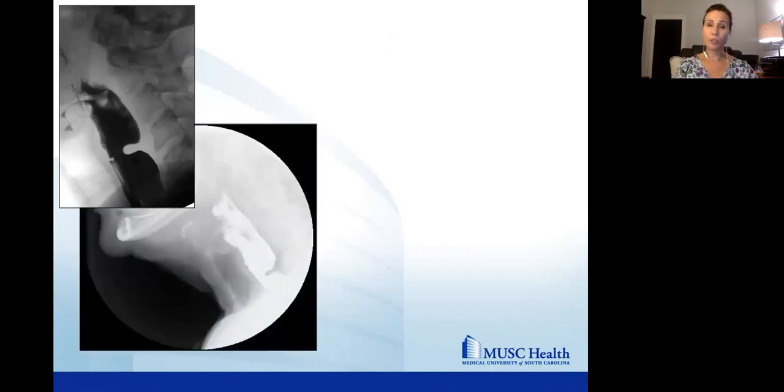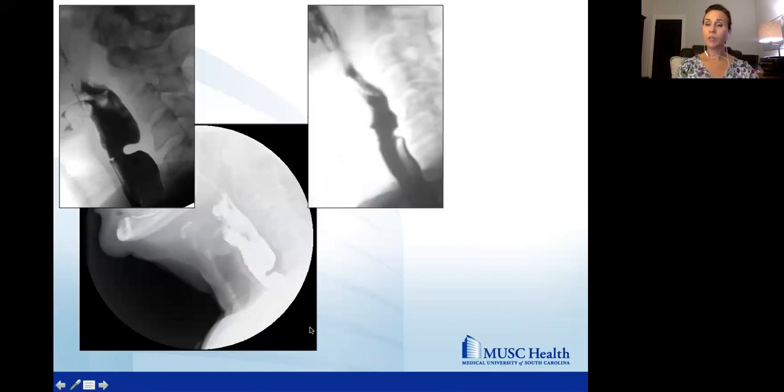But what about this person here? So they also have what somebody may call a cricopharyngeal bar. But these are osteophytes here. What is the contribution of these osteophytes to this cricopharyngeal bar? Is this obstructive or not obstructive? What about this? There certainly is an indentation of the posterior wall. That's sometimes what our radiologists like to call it, but this may be a small cricopharyngeal bar or hypertrophy.